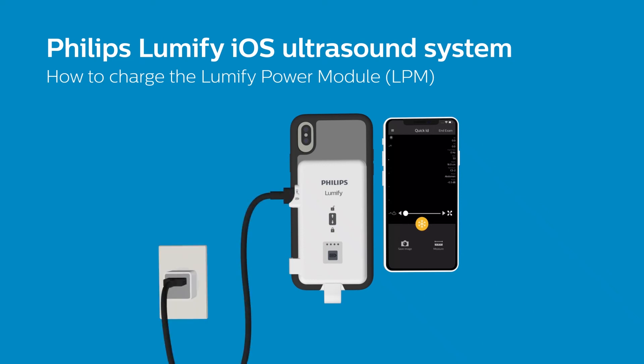When connected, your LPM charge level can be monitored in the top right corner of the Lumify app, or in the menu for the exact charge percentage.